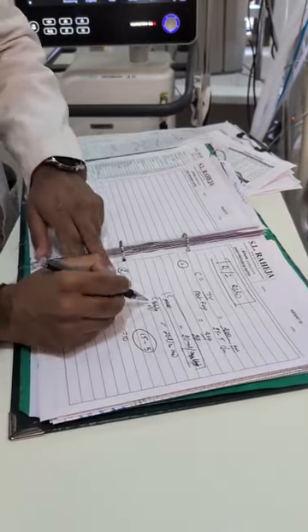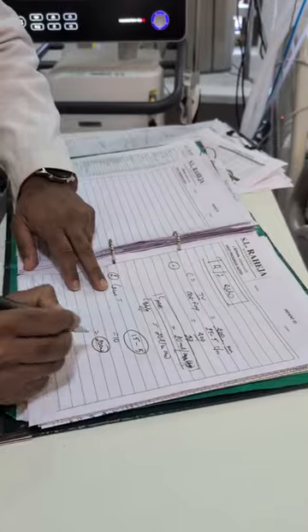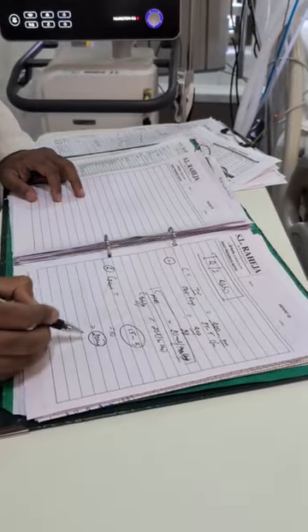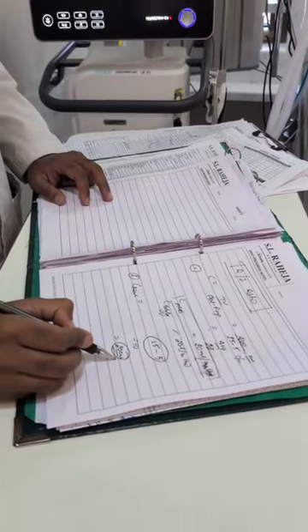Correct? Now this means if the compliance was 20, I am expecting the volume to be 200, because it is after all tidal volume upon plateau pressure minus PEEP. So I am just multiplying these two, and I get a tidal volume of 200. This is what I should get.